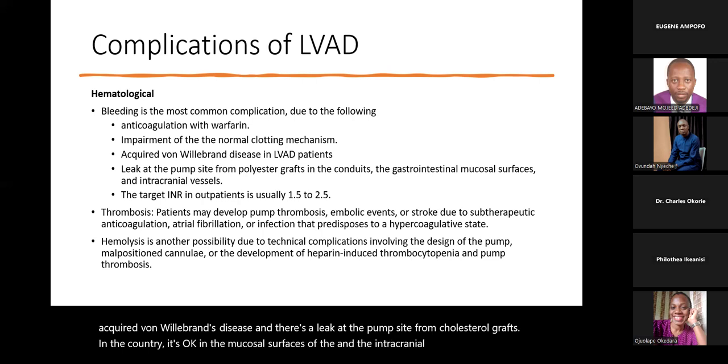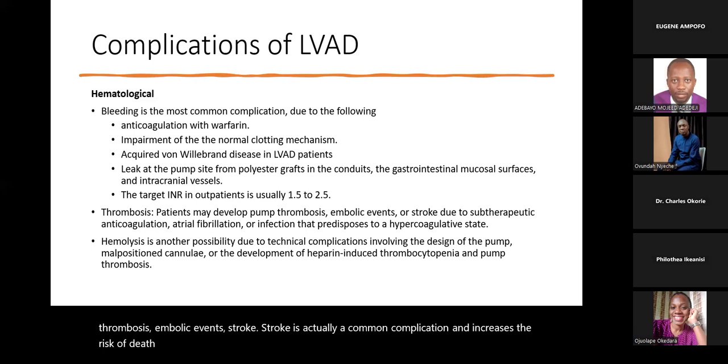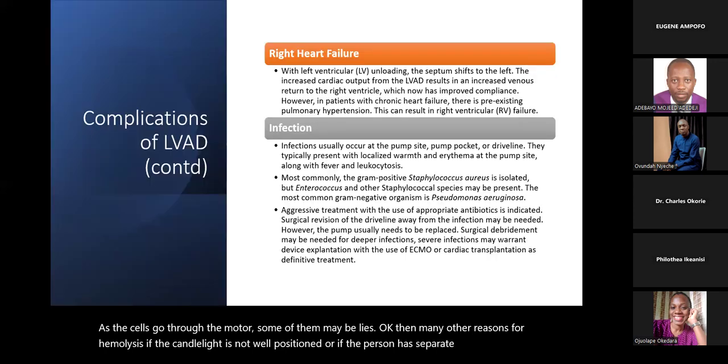The INR for warfarin here is 1.5 to 2.5. Apart from bleeding, they may also develop thrombosis, pump thrombosis, embolic events, stroke. Stroke is actually a common complication and increases the risk of death. Hemolysis: technical complications may also lead to lysing of blood as the cells go through the motor. Some of them may be lysed. There are many other reasons for hemolysis, if the cannula is not well positioned, or if the person has heparin-induced thrombocytopenia, if on heparin.